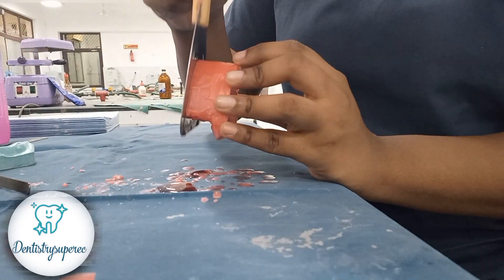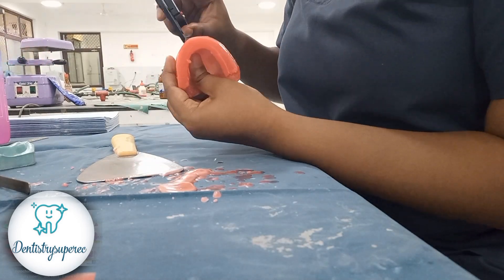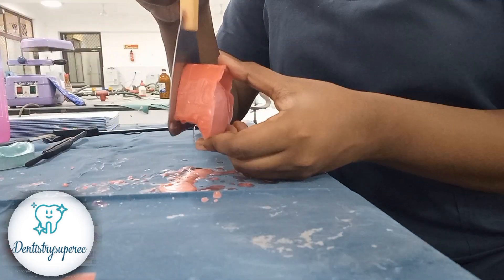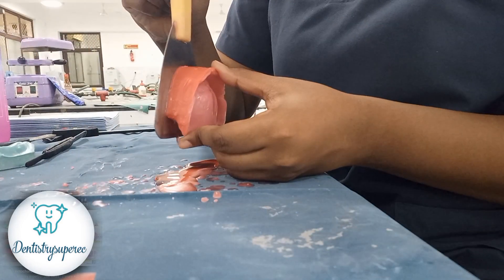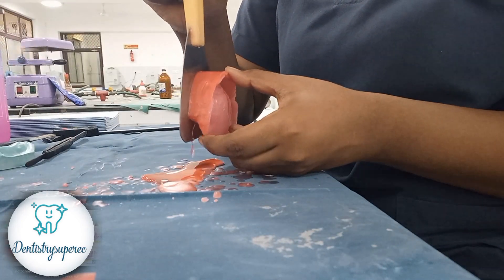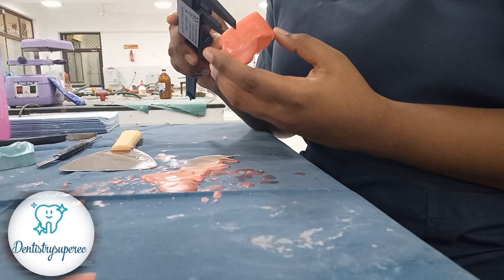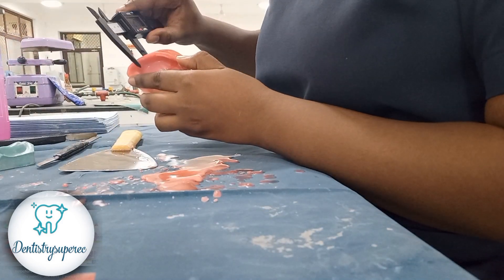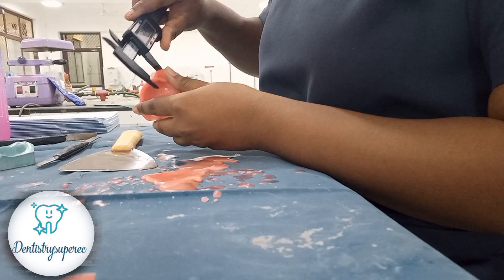The height is more, so we are going to reduce it using the hot plate. It is always advisable to get a vernier caliper — less than 300 rupees from Amazon — for accurate measurement. Anteriorly it should be 22 mm and in the posterior it will be 18 mm; the thickness of the rim can be adjusted accordingly. Currently it is almost in the range of 22.8 mm.